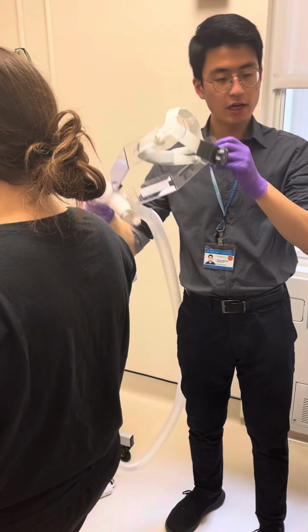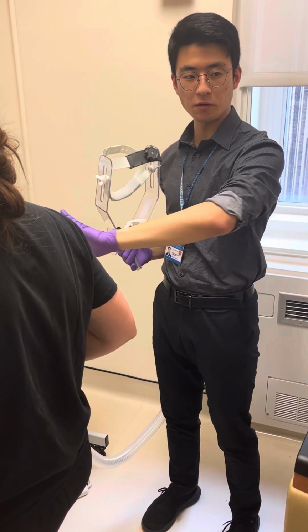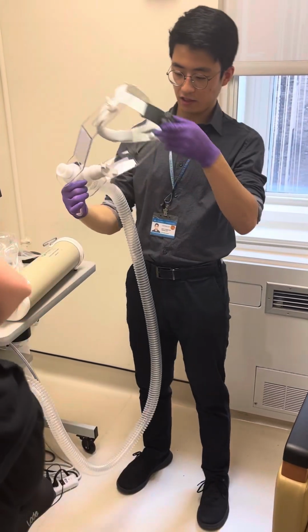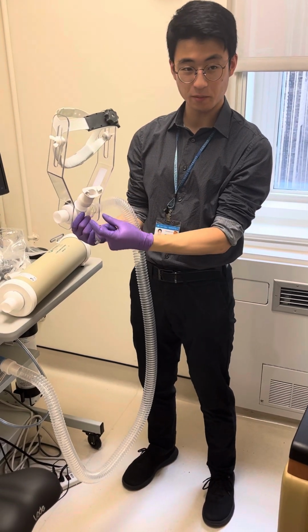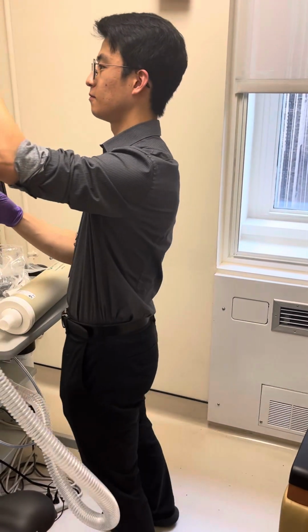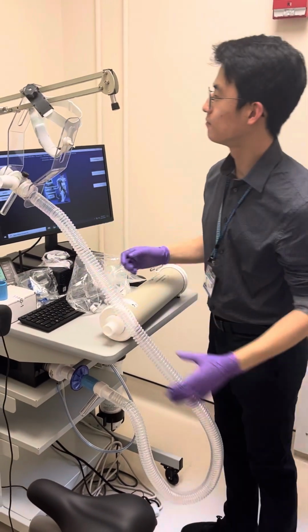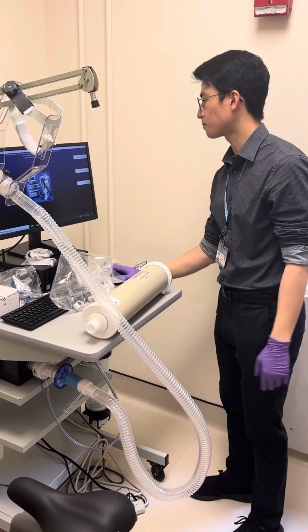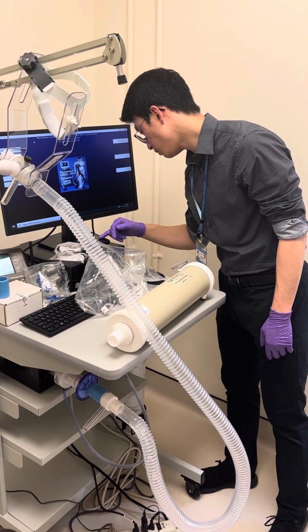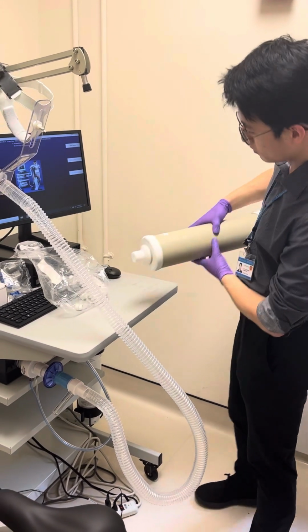Okay. So do that first before proceeding with the rest of it, because if they have this on the whole time and there's some fidgeting going on around here, then it's really uncomfortable. And you probably want to have a clean surface to put this on, because this is going to be in their mouth. So just have somewhere to put it. Yeah, so just do the fitting first before proceeding with the rest of this. I'm going to put this away.